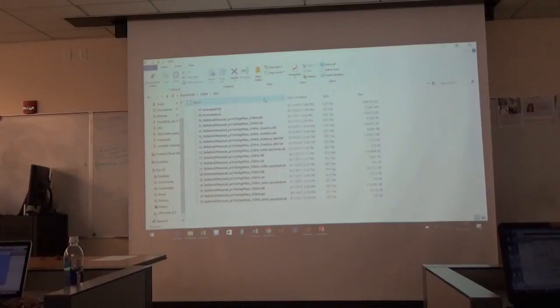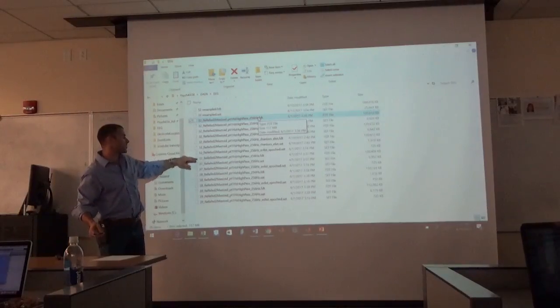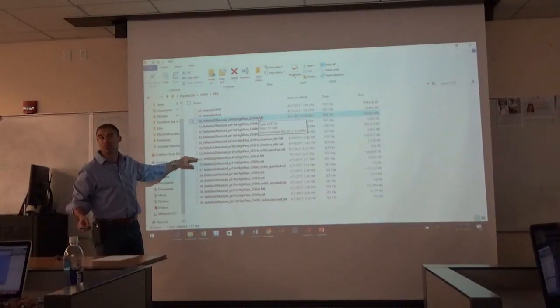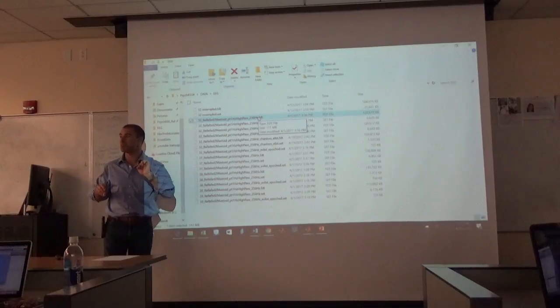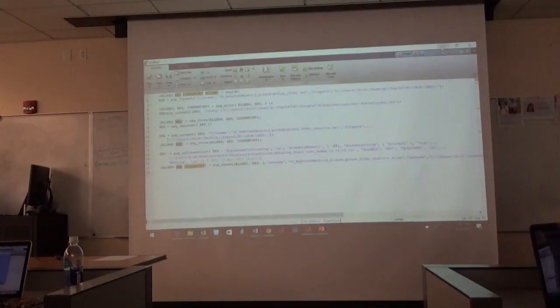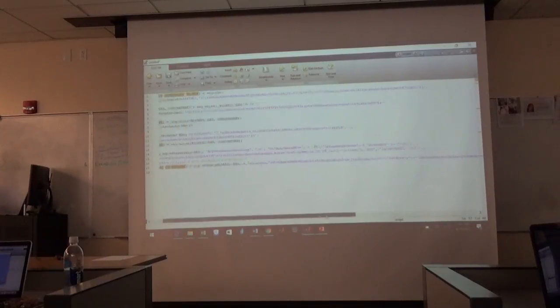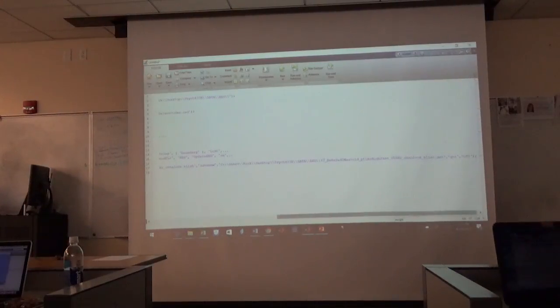So let's say we just did that for subject 32 here, didn't we? What if I want to do that for subject 37? You've got to do all that by hand, right? No. There's a way to zip through it with the press of a few buttons. All you would do is come in here and change the subject number 32 to 37. 32, 37, 32, 37, 32, 37.